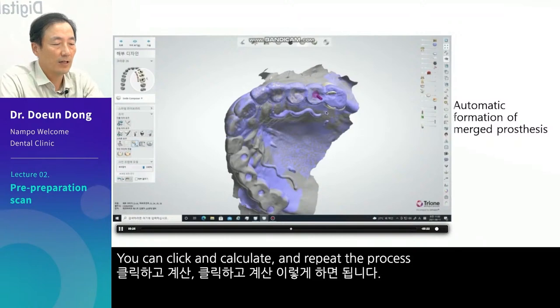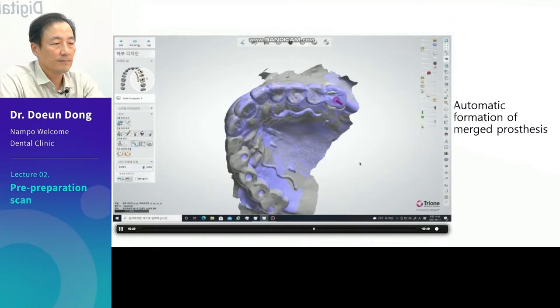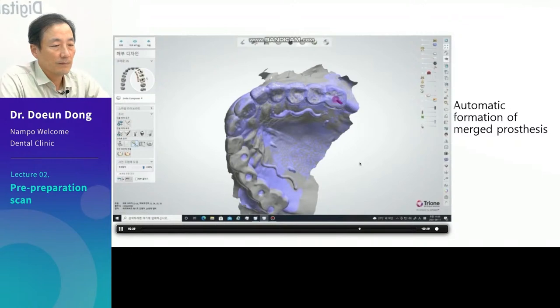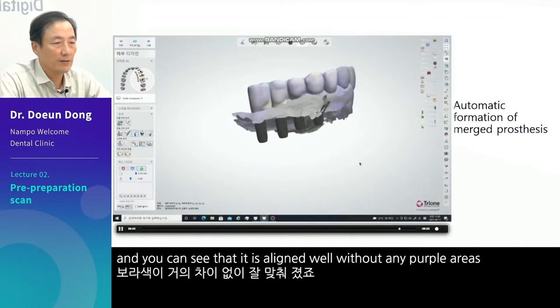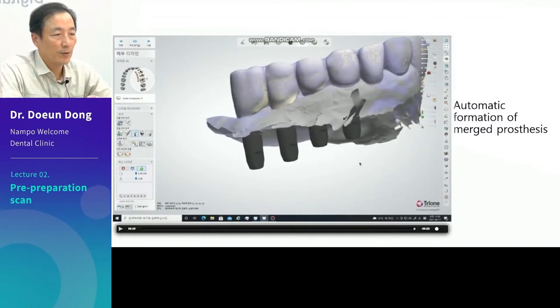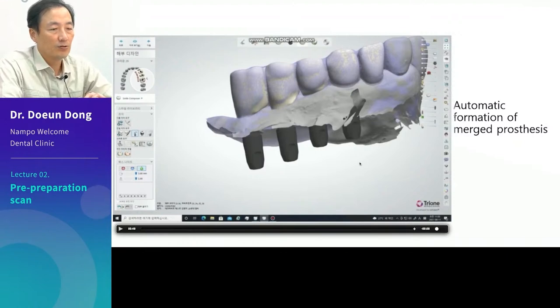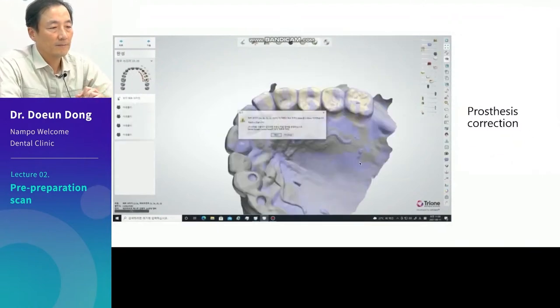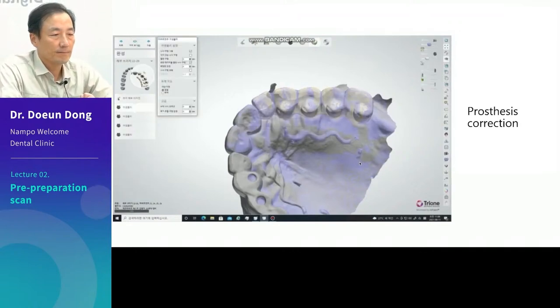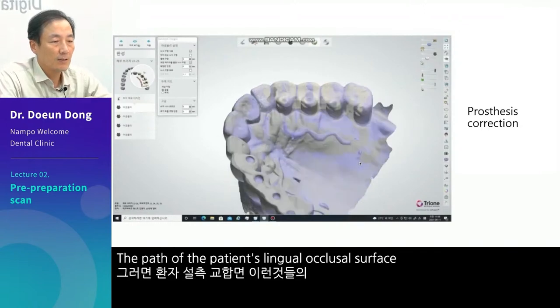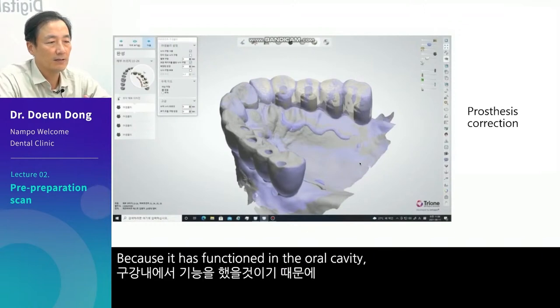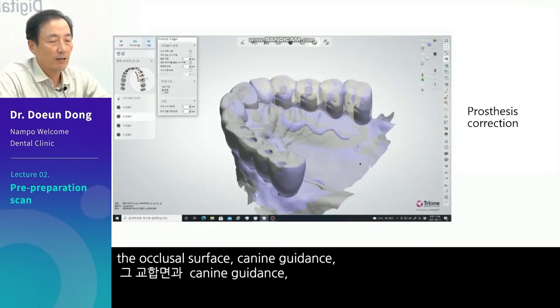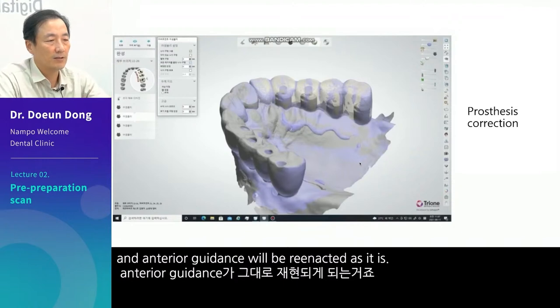You can click and calculate and repeat the process. Calculation is over. This will put it to the nearest area, and you can see that it is aligned well without any purple areas. The rough surface can be smoothed out. The path of the patient's lingual occlusal surface has been functionally generated. Because it has functioned in the oral cavity, the occlusal surface, canine guidance, and anterior guidance will be reenacted as-is.